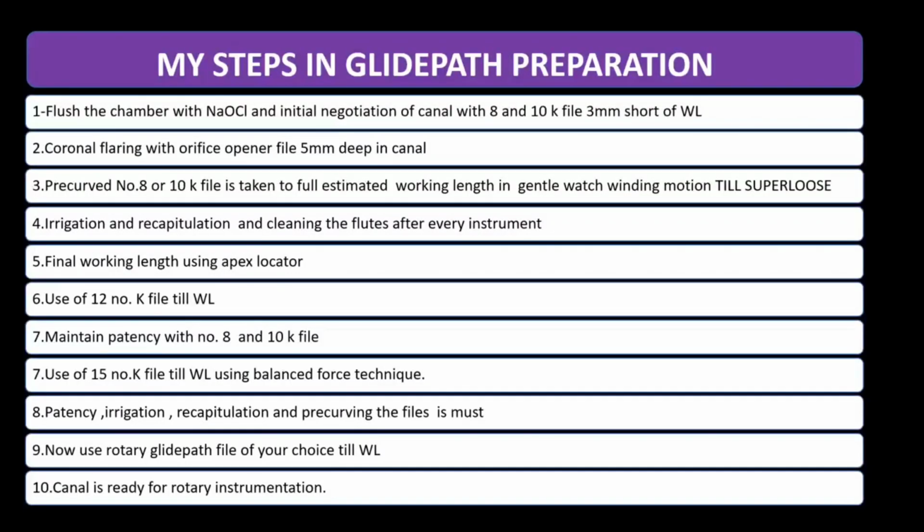Unless you shape it, you can't clean it. Regardless of how efficient, safe and simple a rotary system one is using, if a glide path is not present, the mechanical file will eventually break. And before concluding, let's sum up my steps in the glide path preparation.